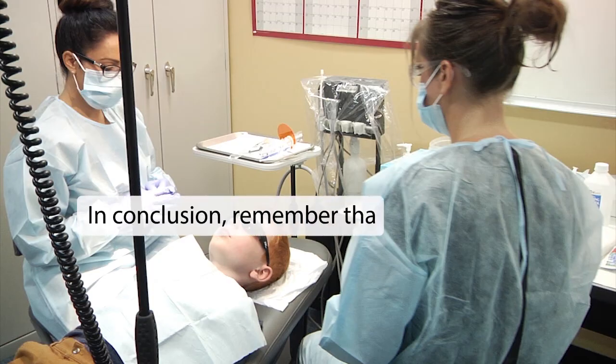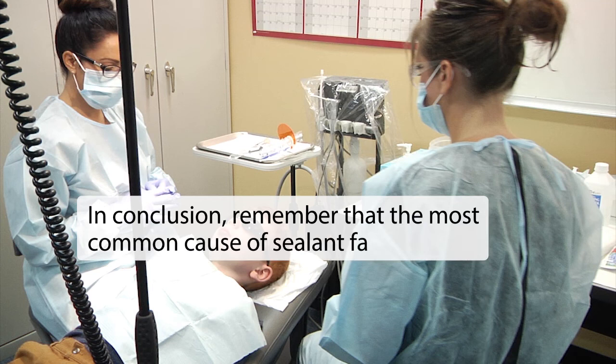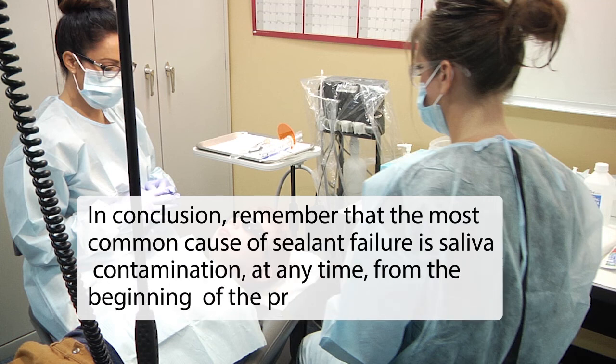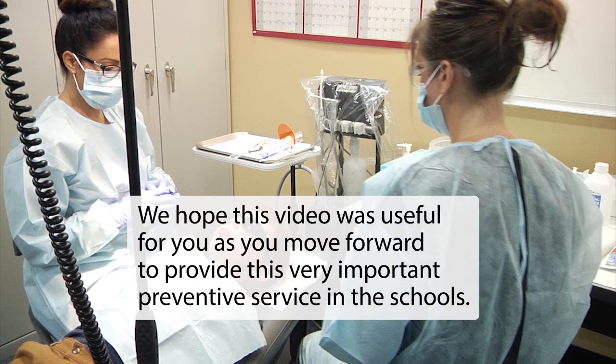In conclusion, remember that the most common cause of sealant failure is saliva contamination at any time from the beginning of the procedure to the end. We hope this video was useful for you as you move forward to provide this very important preventive service in the schools.